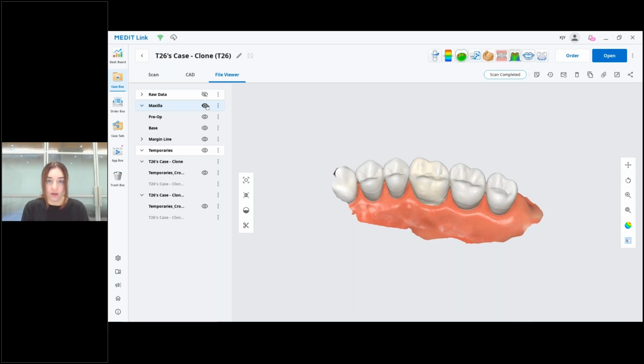We're going to post a list of the 3D printers with which we conducted testing. Even if your printer is not on the list, it doesn't mean that anything could go wrong. It just takes us some time to reach out to all the major companies in the business. But so far, with all the 3D printing testing and milling that I've done, it's been great.